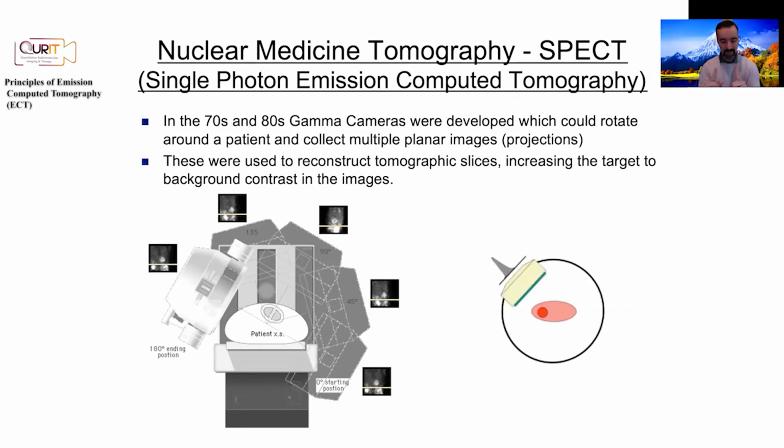So there were people actually that would sit the patient on a chair, and they would rotate the chair. That's the same thing. If the detector is fixed here and you're rotating the chair, that is tomographic imaging. That's an interesting footnote of creativity. People said, well, wait a minute, we have planar imaging. Why can't we turn it into tomographic imaging by this quick fix?